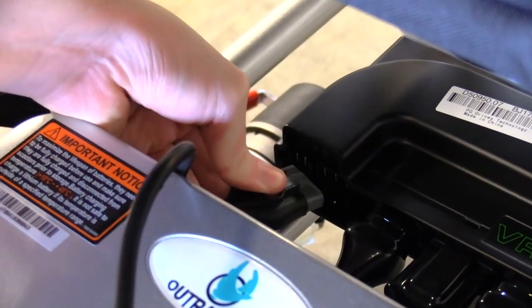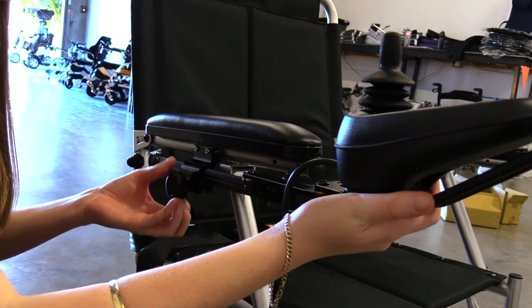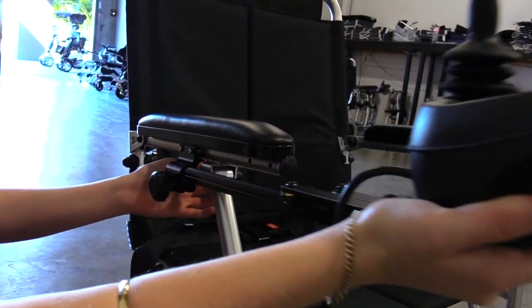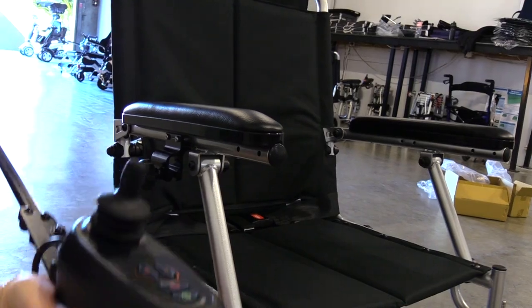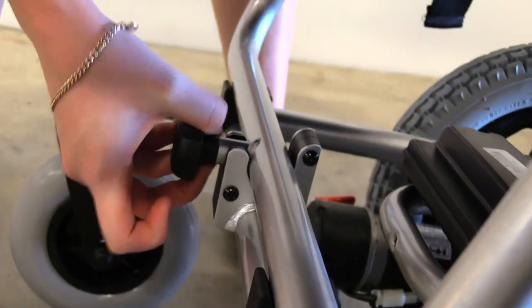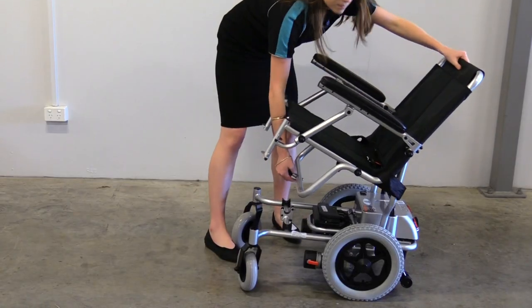Next, remove the control panel. Support the control panel with one hand and loosen the knob. Pull the control panel out from the support bracket. Now you will need to remove the seat. Pull the pin lock out and pull the seat up and out of the connection points.